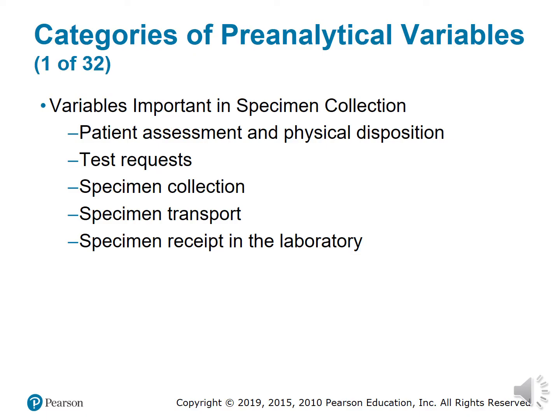As you know, pre-analytical or pre-examination variables are particularly critical because most of them can be controlled by the healthcare worker. Most errors can be avoided if the phlebotomist pays attention to his or her surroundings, properly checks a patient's ID for correct name and date of birth, correct spelling of the patient's name, and makes sure that all information on the orders matches what the ID bracelet has.